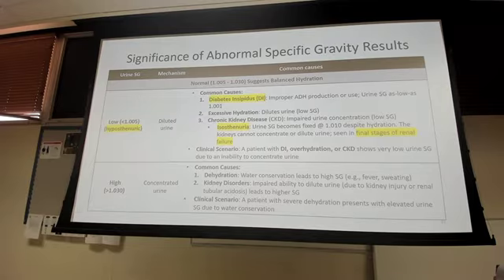All right, so what is the significance of an abnormal specific gravity result? This is very important because we're going to be talking about diabetes, so you all got to really know that, right? So we have low, less than 1.005, hypostenuric. You will see that in diabetes insipidus. Anything that's high, of high specific gravity, you'll see that in dehydration, kidney disorders, okay? So what is the term for low specific gravity results? That's highlighted there. Hypostenuric, and a common cause is what? Diabetes insipidus, good.